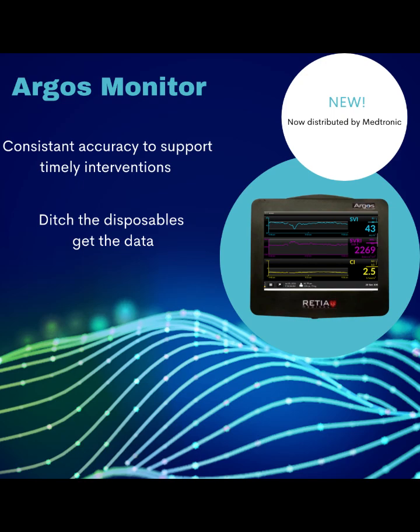Welcome to the video tutorial for the Argos Advanced Hemodynamic Monitor. Ditch the disposables and get the data.